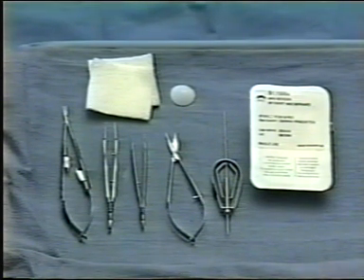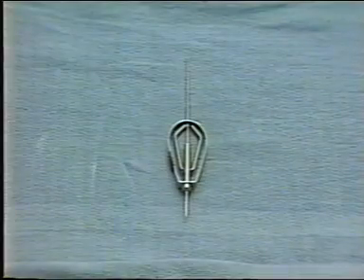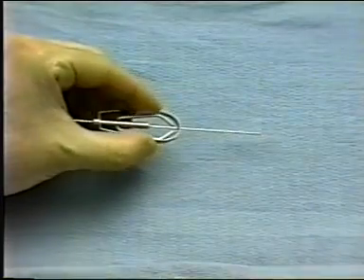The equipment includes the Mini Monoca and the inserter. The local anesthetic used is xylocaine 2% with epinephrine for hemostasis. Be sure to have available all necessary equipment, including the inserter, which we see here demonstrated.